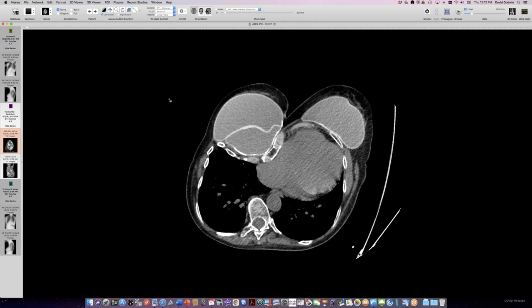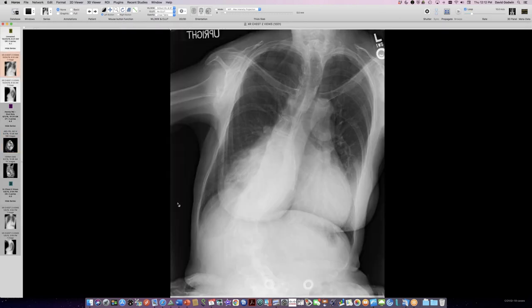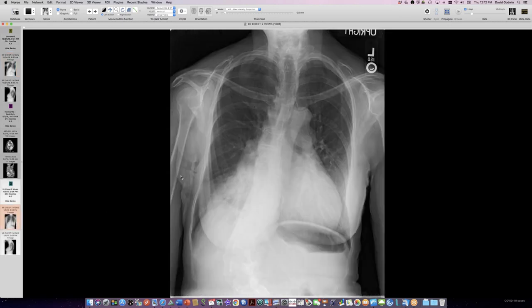Okay. Can you show us the frontal again one more time? One of the frontal radiographs? Here's the current, the 2019 frontal radiograph and the 2015. Okay. Yeah, okay. And yeah, good case. Pectus pneumonia. I think I would fall for this one every time without a lateral view. Okay. Great. Thank you. Yeah, thank you.